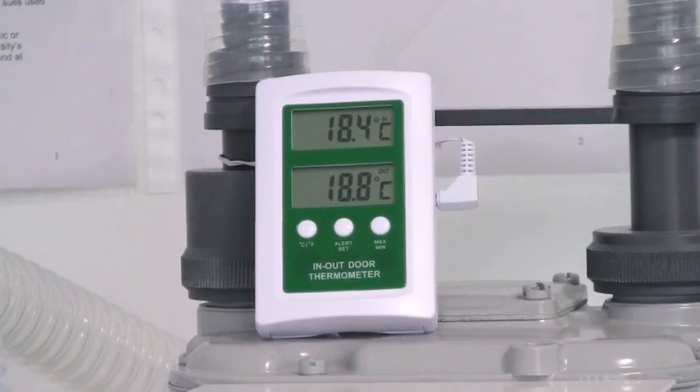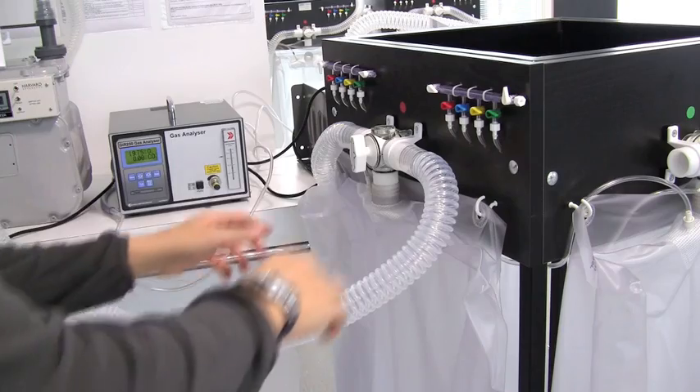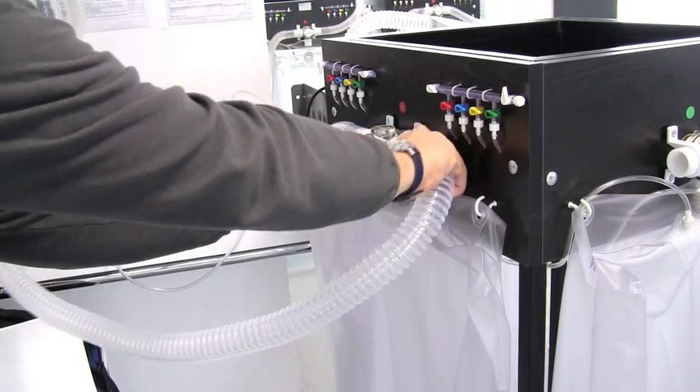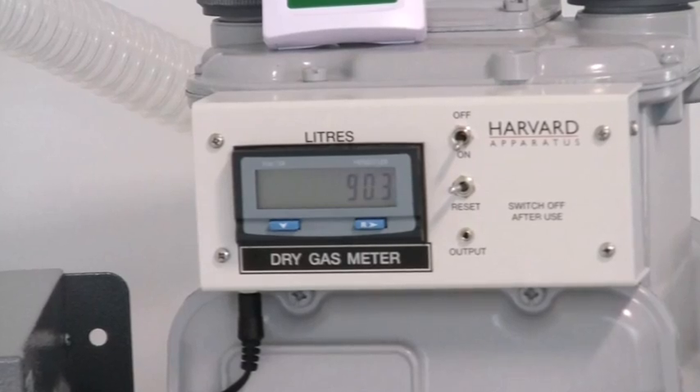Make a note of the outside temperature, which reflects the temperature of the air inside the bag. Once the bag has been emptied, turn the machine off and close the valve on the Douglas bag. Make a note of the total volume of air that has been evacuated.